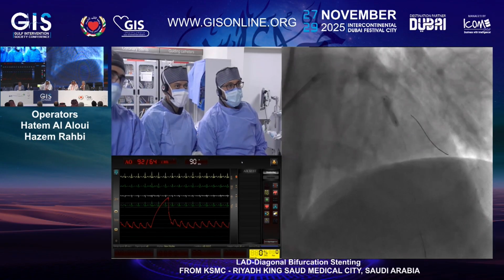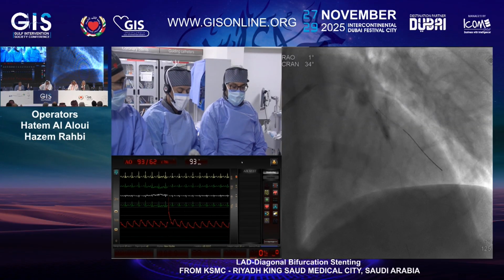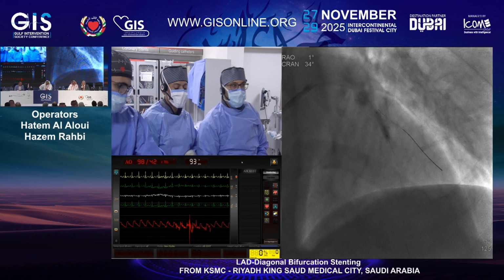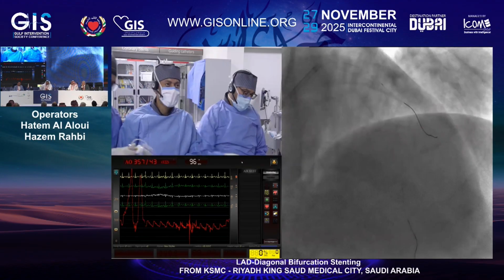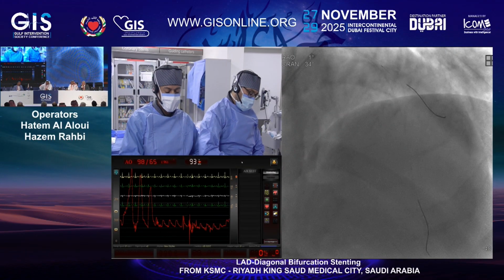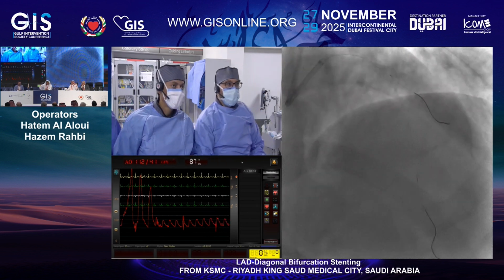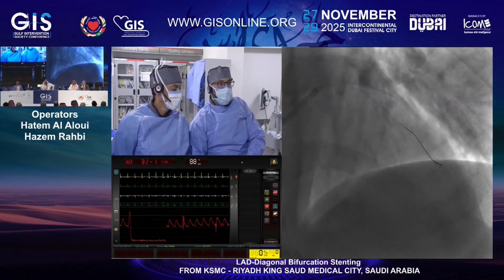Okay, I would say it is 3.5. Yeah, I think so. I think it's 3.5. That's better, the IVUS. Better. The larger we go, the more we have risk on the side branch, of course.